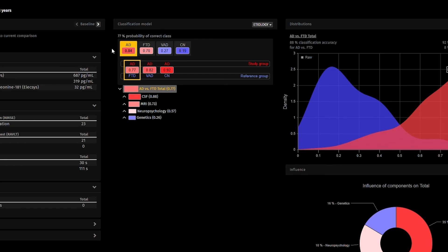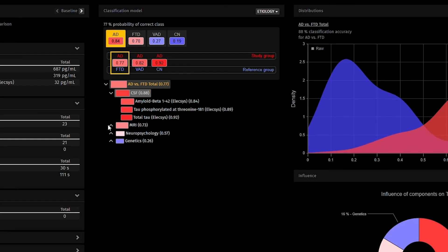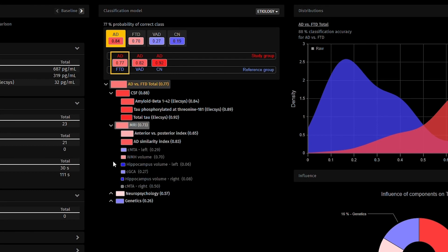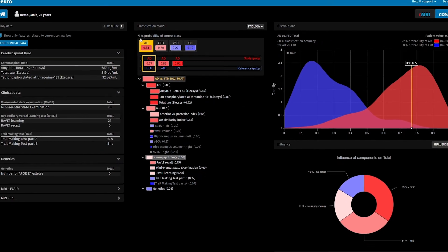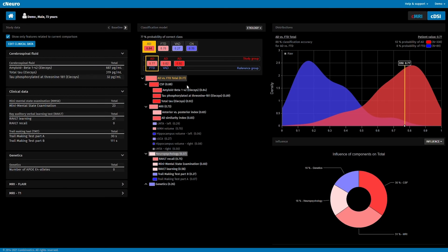The clinician can then review which disease is the most likely for this patient, which is Alzheimer's disease in this case. View information about progression and see how individual biomarkers contribute to these suggestions.